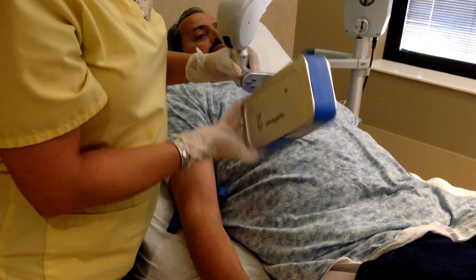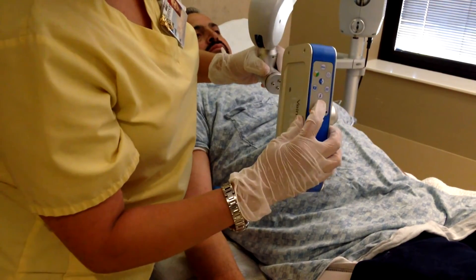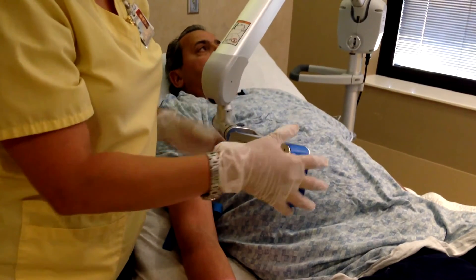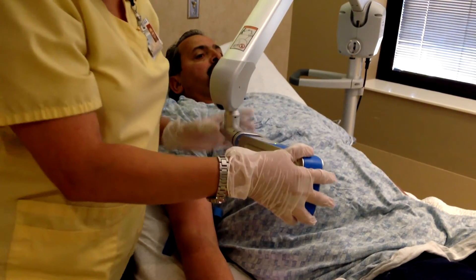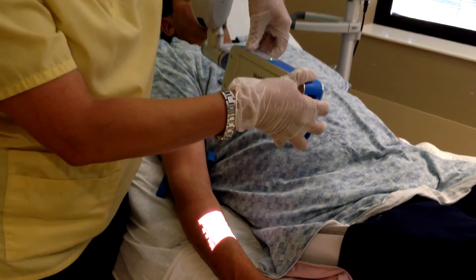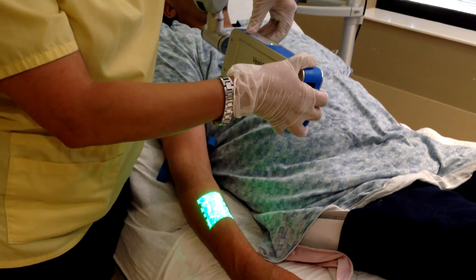The camera's right there. It's very flexible. It helps you to see veins in a patient's arm that you may not be able to visibly see or feel with your eyes or hands. I think it helps improve patient care and it helps reduce people having PICC lines, which can increase the risk of infection.